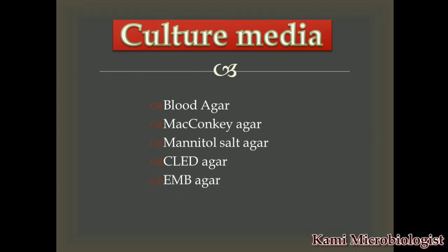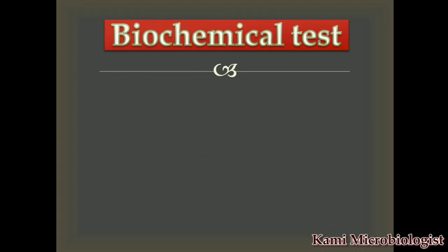EMB agar is also important because it is specific for E. coli, and it also shows lactose and non-lactose fermentation. Now these are the culture media that we talked about. Let's see the biochemical tests, what type of biochemical tests we should perform while doing prostatic fluid culture and sensitivity. First is the Gram stain. You must do the Gram stain.